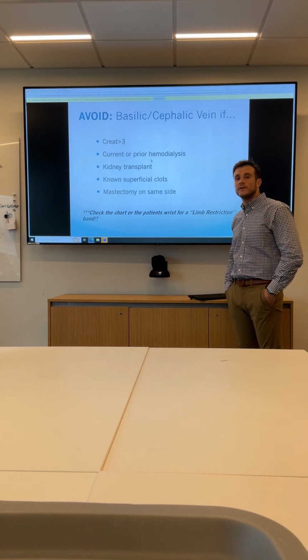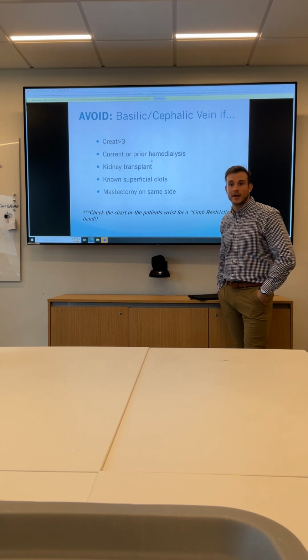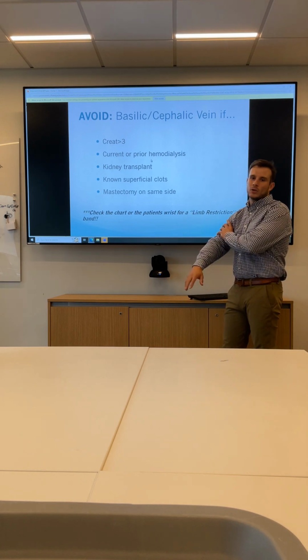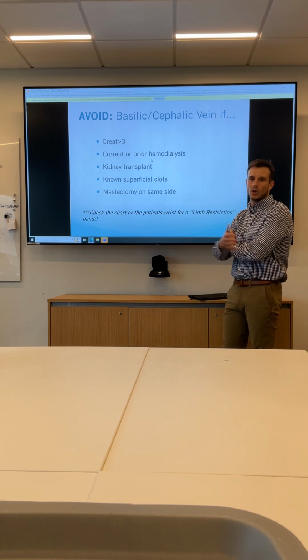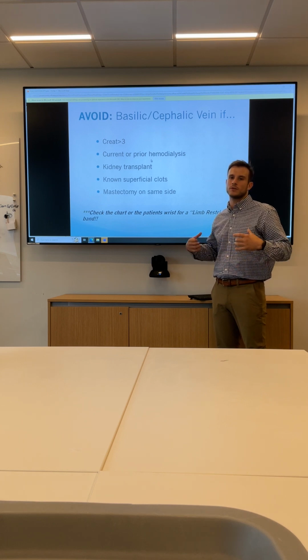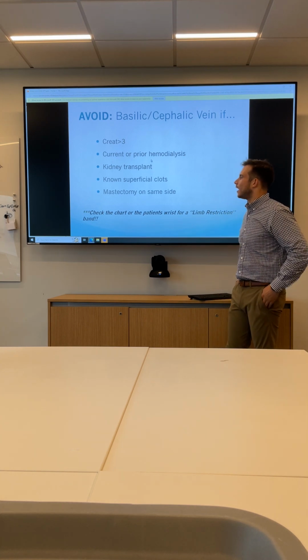If they have known superficial clots, so if they're holding anticoagulants, or they're a post-surgical patient not on anticoagulants for post-operative bleeding, but you know that they're at risk. Sometimes you can actually visualize clots with the ultrasound machine. So if you know that there's clots in the arm, it looks more red, more edematous, more swollen, they're complaining of pain on that side, just avoid it and look on the other side. And also if they've had a mastectomy on the same side, any patient with a breast CA history, always be sure that there were no lymph nodes, mastectomies, things removed from that arm, as we like to avoid placing IVs on those arms because of the disrupted anatomy above.